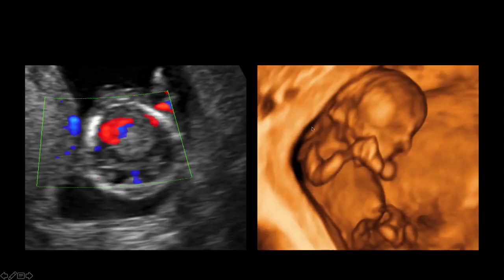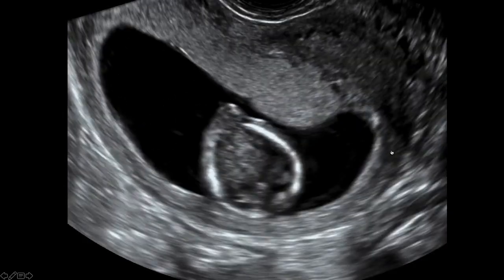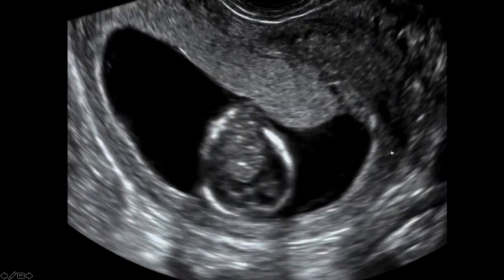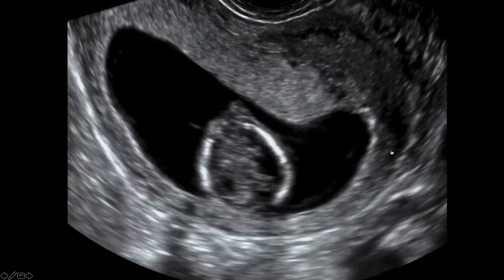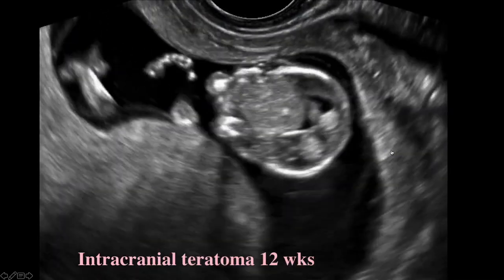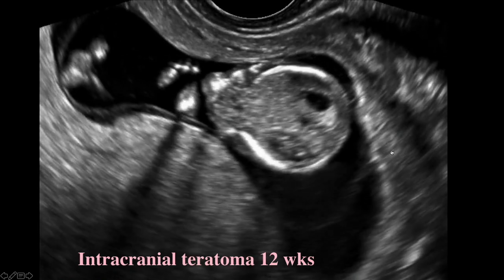Let's look at a little bit more detail here. Lots of color, so it's not a bleed. There was lots of color in here, and you can see the face is disrupted here. This is a piece of the tumor coming out here. Again, here you can see how it looked as we scan through. The face is completely destroyed by this tumor. She had a termination of pregnancy, and this proved to be an intracranial teratoma. And you can see how incredibly destructive this tumor was to the face.